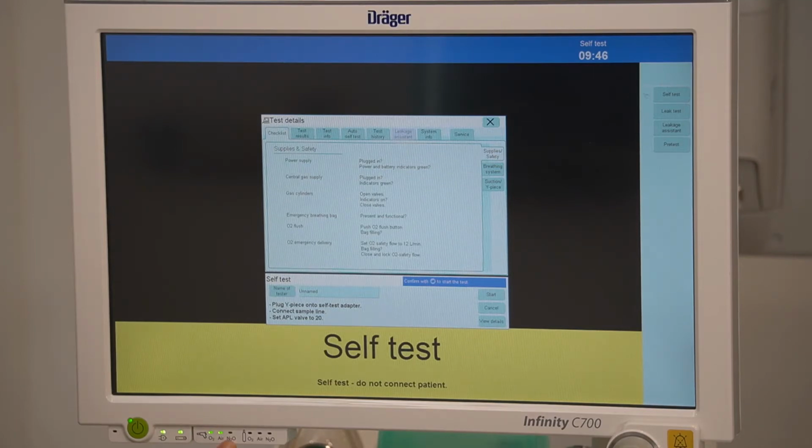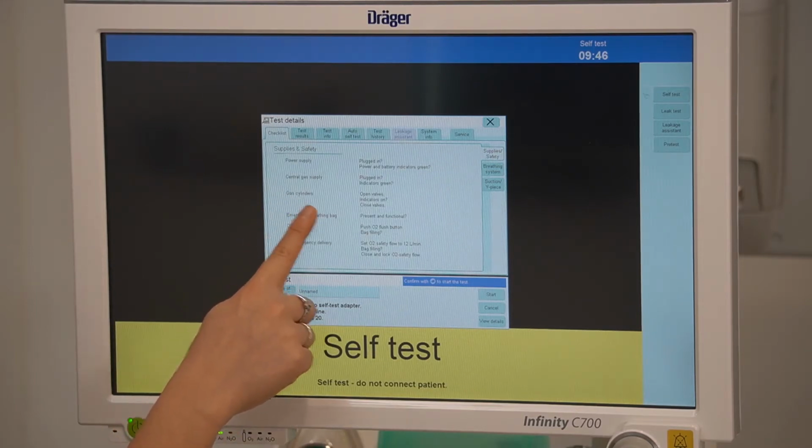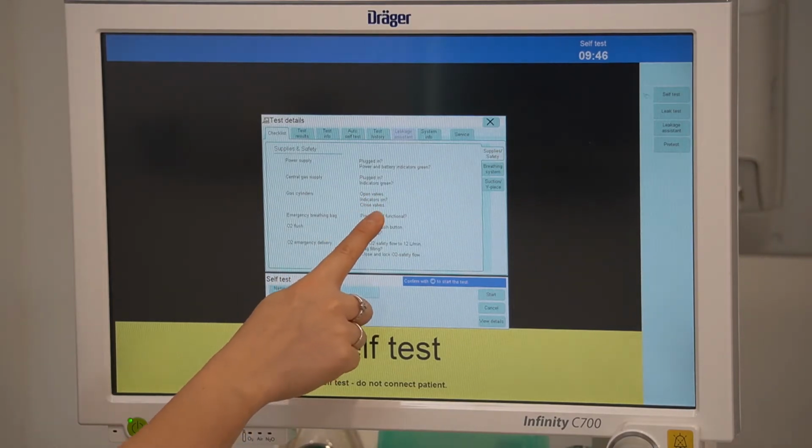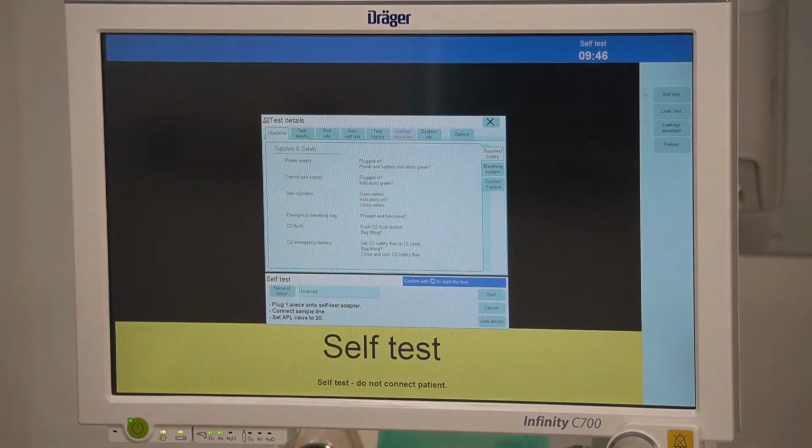In this video, I'll be demonstrating how to prepare for the system test on the Zeus IE. When the device is powered on, you will see the checklist for the system test displayed on your screen. Otherwise, to access the device test, select it from the right-hand side menu. The system test should be performed every 24 hours or every time the device is switched on to check for operational reliability of the device.